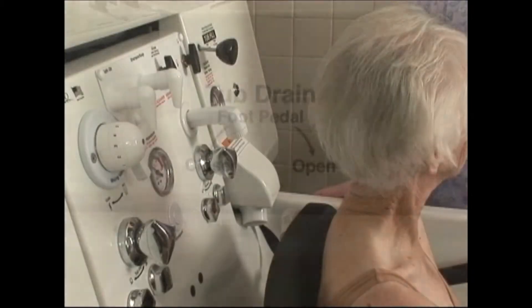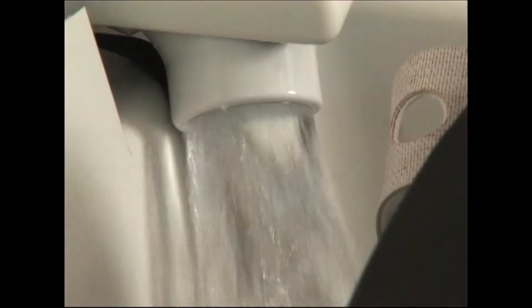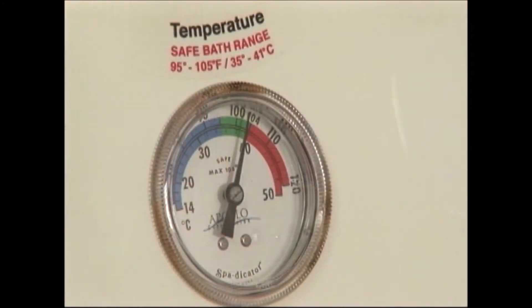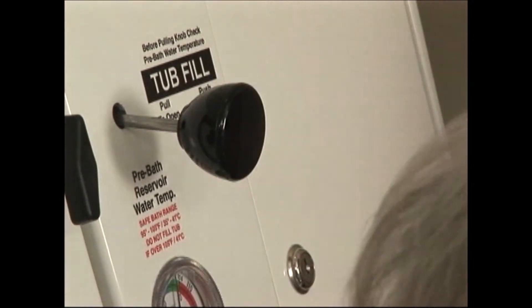Fill the tub by pulling the black tub fill slide handle. In just minutes, the tub will provide chest-high immersion in 104-degree bath water.